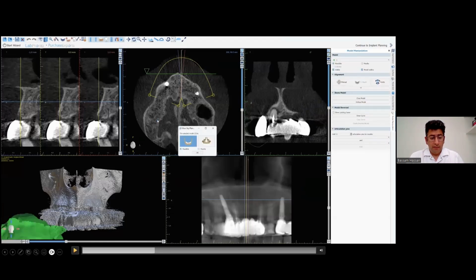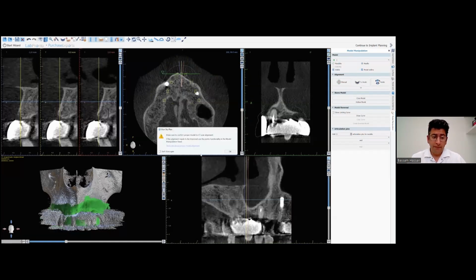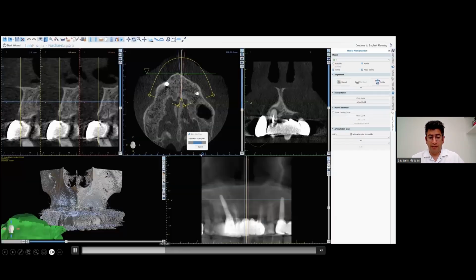You see here how huge the scattering is, and how much scattering you have. Still, the AI nowadays, which does this automated alignment, is able to segment in a better way. It does not seem very logical that the AI is able to do automated segmentation, although you have more artifacts.